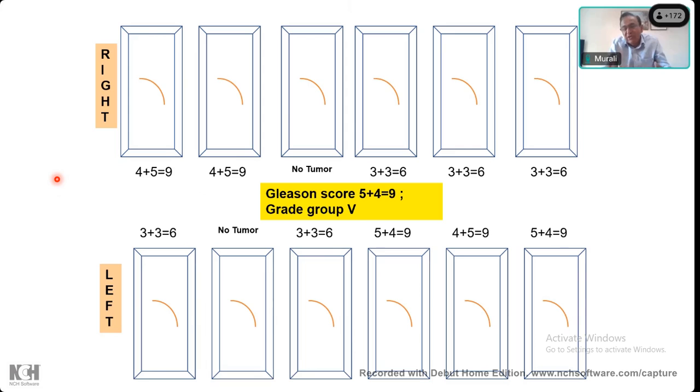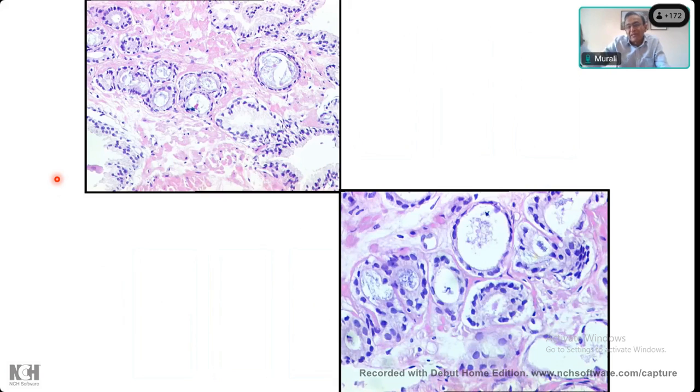But for us, we do the reverse. We give a global score for every case. And if we think these are 2 tumors, then we raise the possibility that this might be a separate higher grade tumor. So it's 2 different ways of doing it.